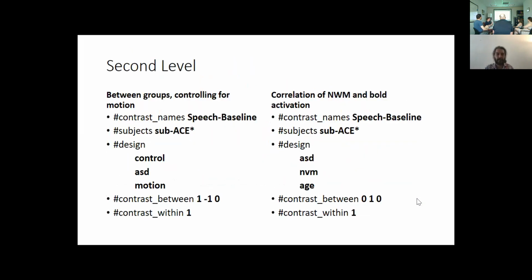So that is all of those things I have. So those are the config. Okay, just a couple of minor comments, because we have been developing this whole FL pipeline. In the process, there have been some leftovers that perhaps I didn't clarify much. For example, the subjects field is pretty much unnecessary in most analyses now, because it's strange to have the case where you want to manually specify a different subset of subjects than all in the experiment. Typically, when you want to select a subset, you do it using the particular control covariate in the participants TSV file. So you no longer typically use the subjects field when creating a second level covariate.